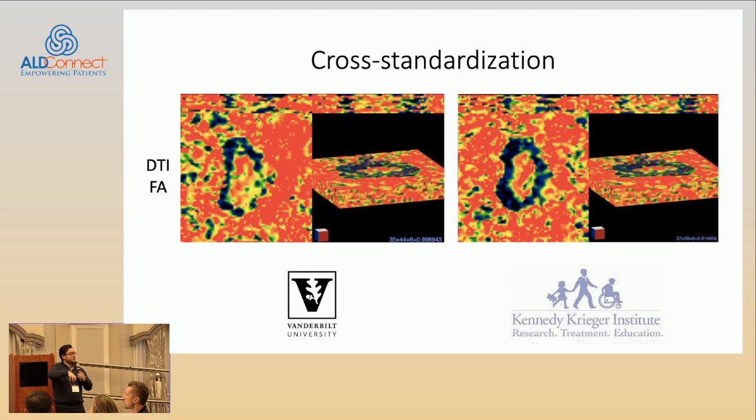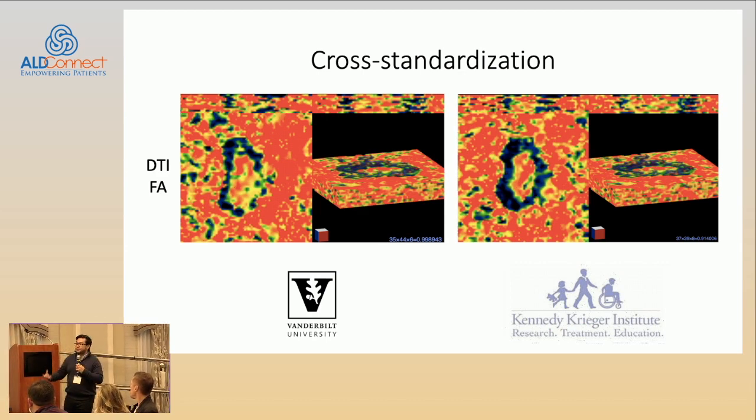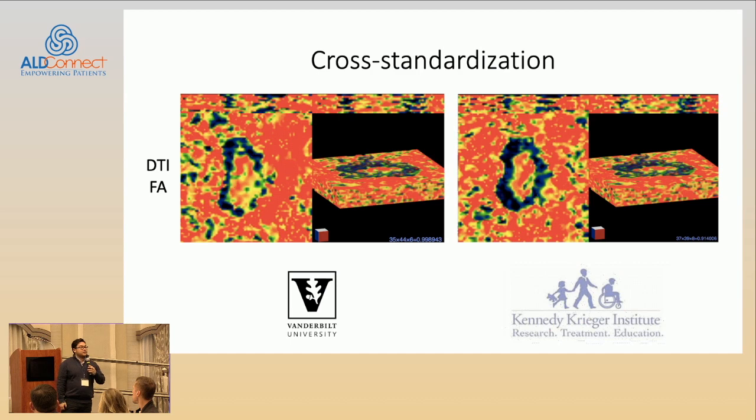DTI is able to show the direction of water movement, and this shows within that mathematical model the neurites sprouting out to the side. Thinking about the pathology from recent publications, where there has been damage described to these neurites, or pruning, or loss of volume due to damage, this would be a method that would image exactly that.